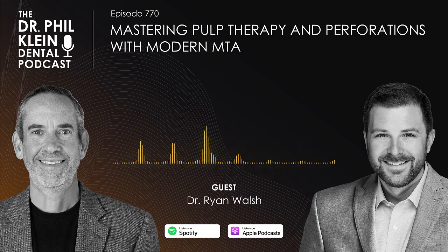You got it. And make sure, that was a really good point you made, Dr. Walsh, is not to let any of that MTA get down the canal. Because first of all, if it sets up in the canal, that's not fun, right? Because yeah, it's tough. You've just blocked yourself off. So for our GPs out there that are doing this, what's your recommendation so that that doesn't happen and the canal stays patent?